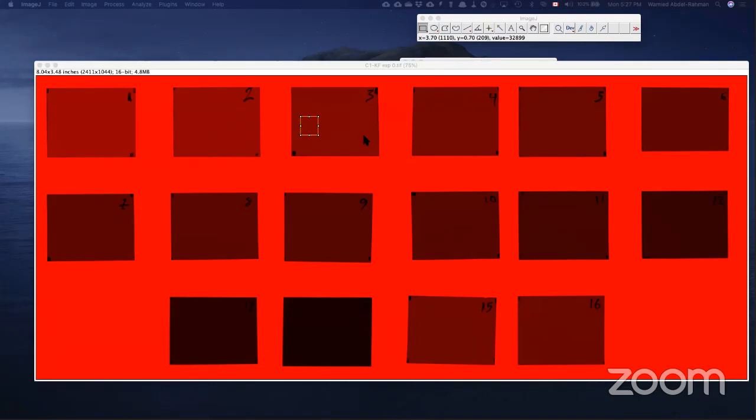We don't have a stereotactic program yet in our department. But my suggestion is you do the calibration. Okay? So you do it and then you tell us, can it be done or not? I think it can be done, because even if the red channel saturates, the green channel is also going to be available.